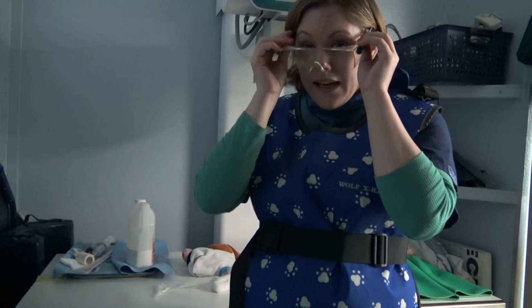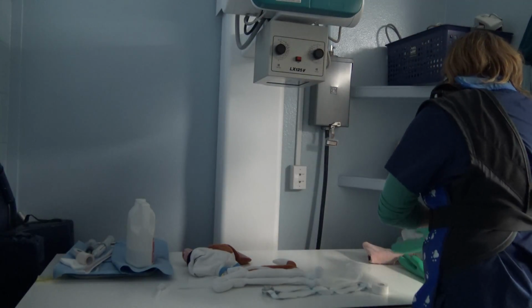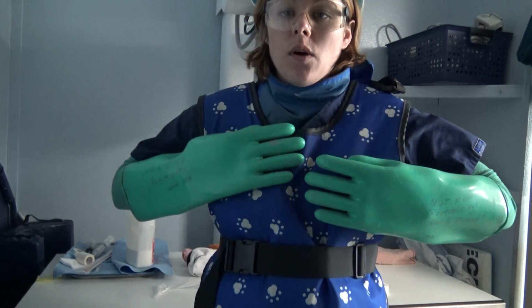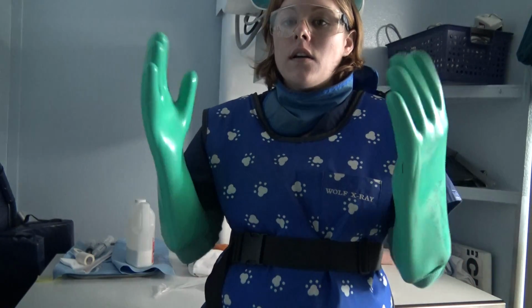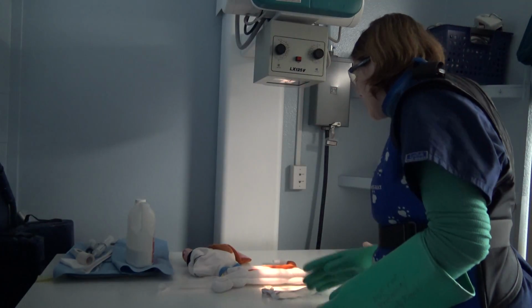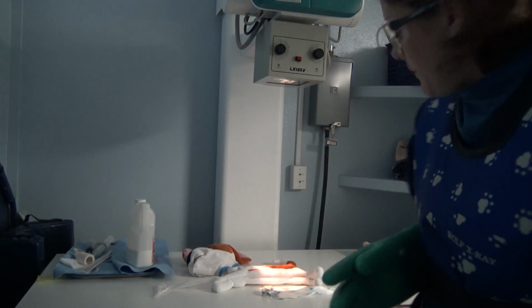I am putting on my glasses and my gloves. If I was in the room restraining, you would want to make sure you have your thyroid shield on, your lead gown, your gloves, and your glasses. So I'm going to go ahead, and now that I'm sure I've collimated appropriately and I have my dosimeters, I'm going to take the x-ray from outside of the room.